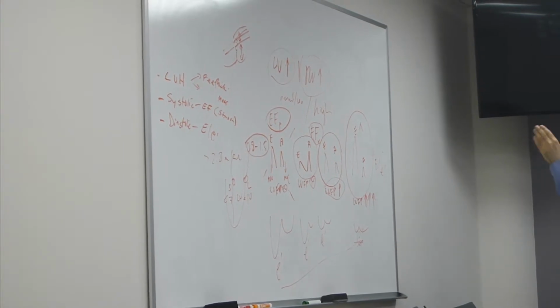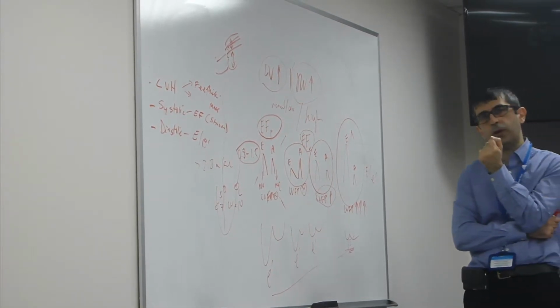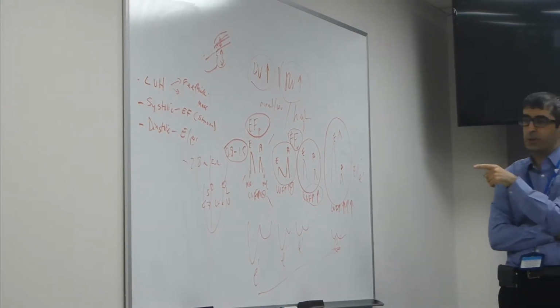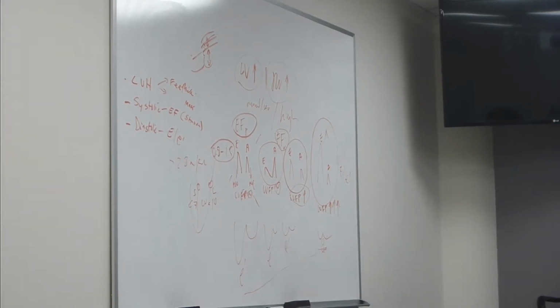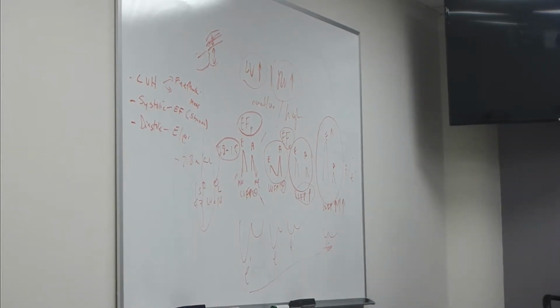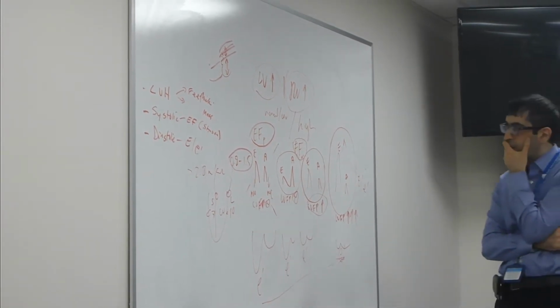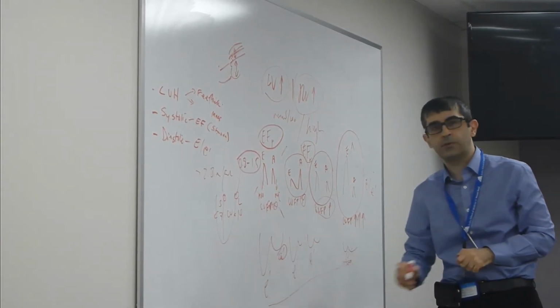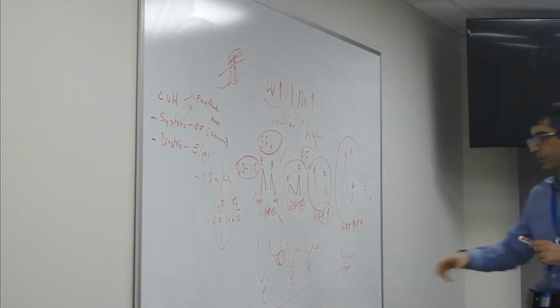Right. The problem is that in the tissue velocities, A prime doesn't factor in that much. We look at the mitral inflow when E-to-A ratio is important. With the tissue velocities, it's less important, because the myocardial recoil with atrial relaxation has less value than recoil after the early filling or during the early filling. So I wouldn't rely on the A prime to make any significant decision. We don't even measure it in the echo, while we are very careful about the E prime.